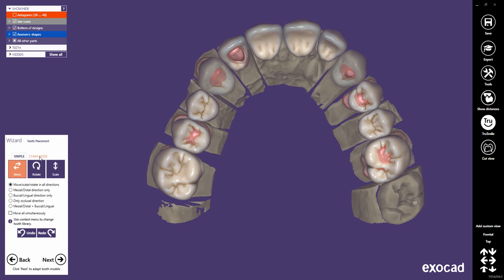The general tooth placement functions you should already be familiar with are still available in the Simple tab. These will be explained in a separate tutorial.